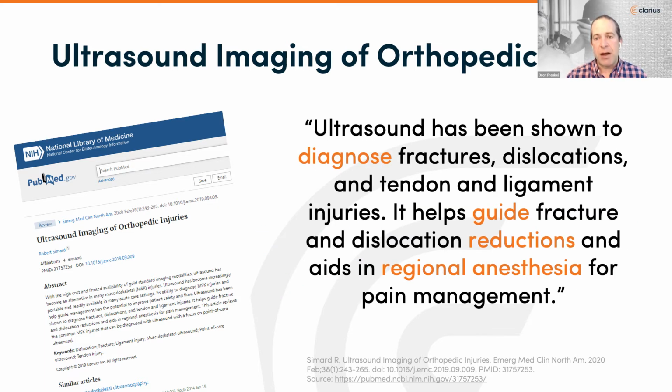As we did this background research, we really found it's across the board that ultrasound can, and we know in clinical practice does, diagnose everything from fractures and dislocations to tendon and ligament injuries. In emergency medicine, it can guide fracture and dislocation reductions, and we can use it in regional anesthesia and pain management, which we've done other webinars on.